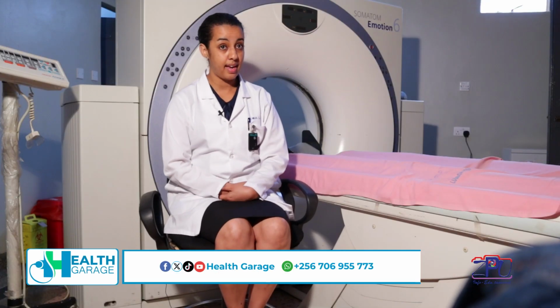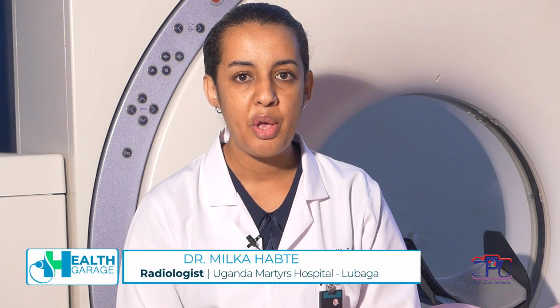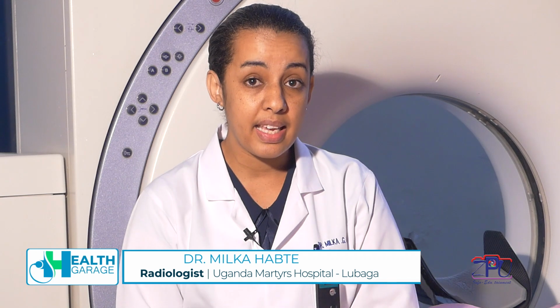Currently, we have a CT scanner which we've used since 2016. It's a 6-slice CT scanner. Yes, it does the basic investigations, but because of the thick slices it produces, and because it's a bit slow, it's not able to give us the clearest images. So it can also hinder us from reaching the accurate diagnosis and making the right decision.